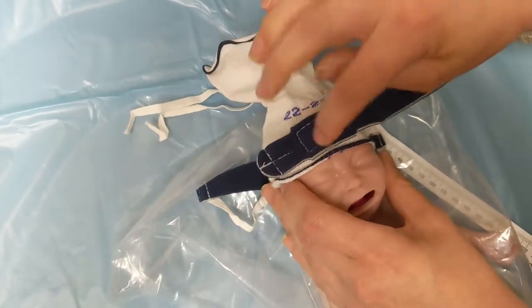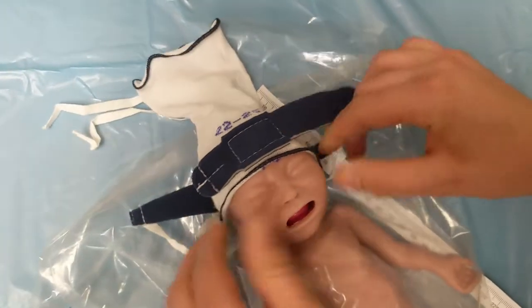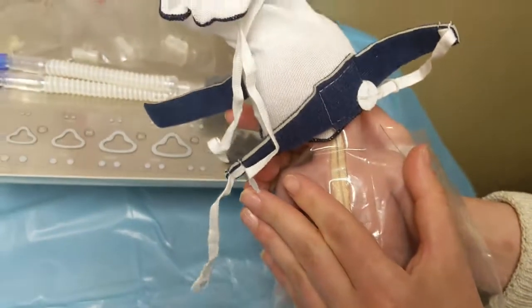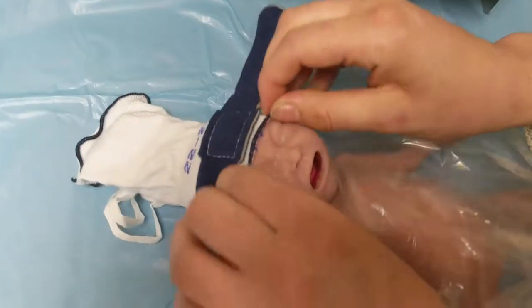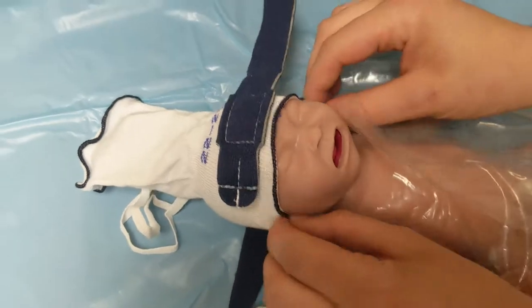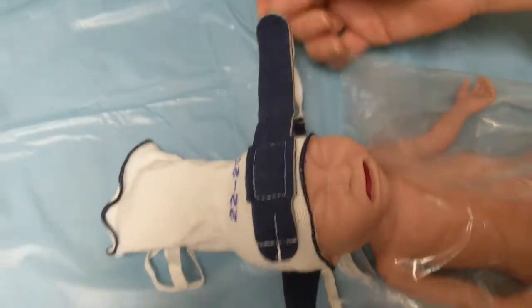We want this to be midline. We want to double check that we're meeting our standards. We want this to be all the way at the base of the neck. We want the front of the hat to cover, be on top of, or just above our eyebrows, and our ears to be covered. So we look good.